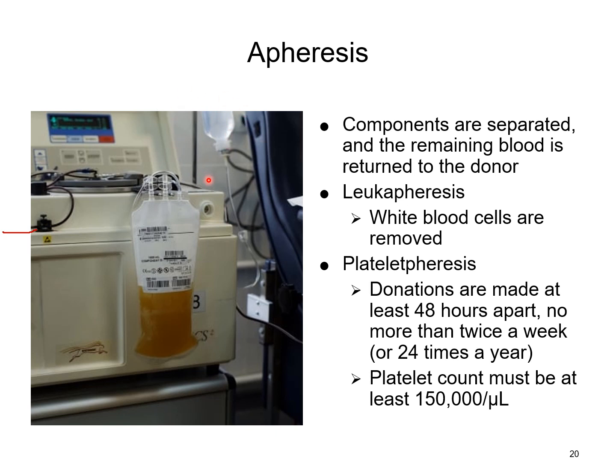It's a little bit more complicated, but once it does that separation, whatever product you're trying to get from that patient, whether it's leukocytes or platelets, not really sure what this is. It's either plasma or platelets. The bag kind of looks more like plasma. Whatever product you're removing will go into the bag, and the rest of it will go back into the donor. I think this may be the line here that's returning back to the donor. It's really hard to tell because of the color, and it could just be a cord.